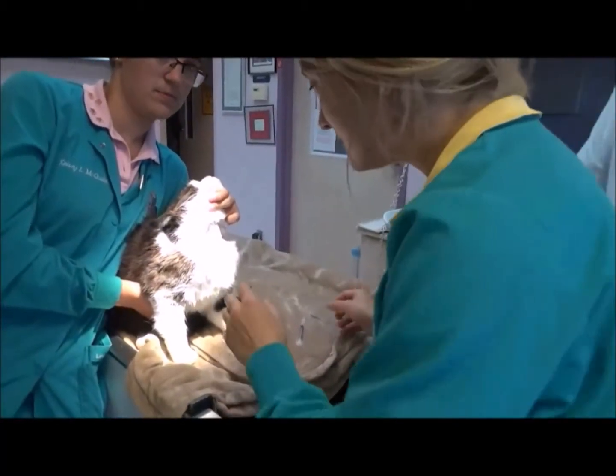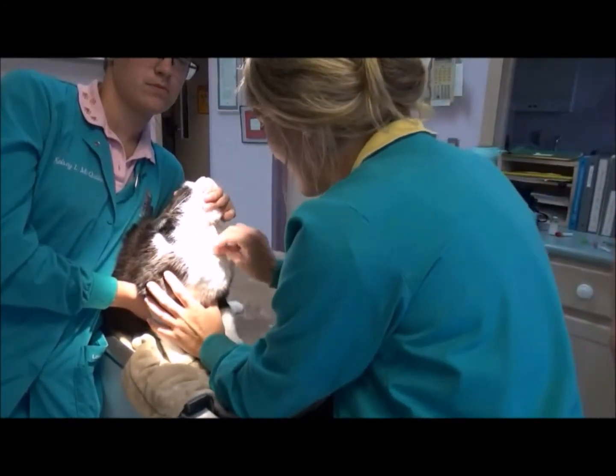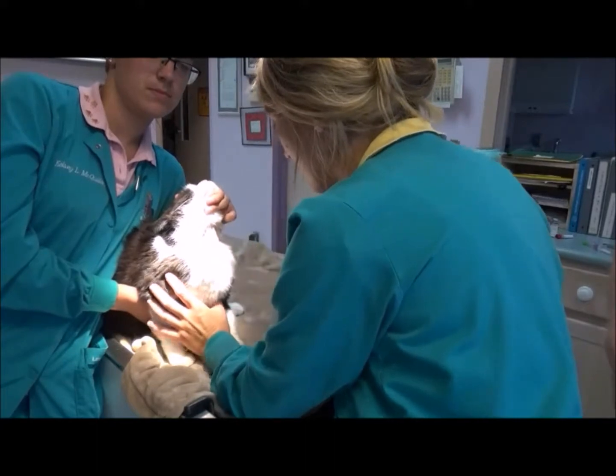Now I'm going to get a blood sample from the jugular vein of our feline patient. I pre-clip the area, and now I'm going to cleanse it with the alcohol rub.